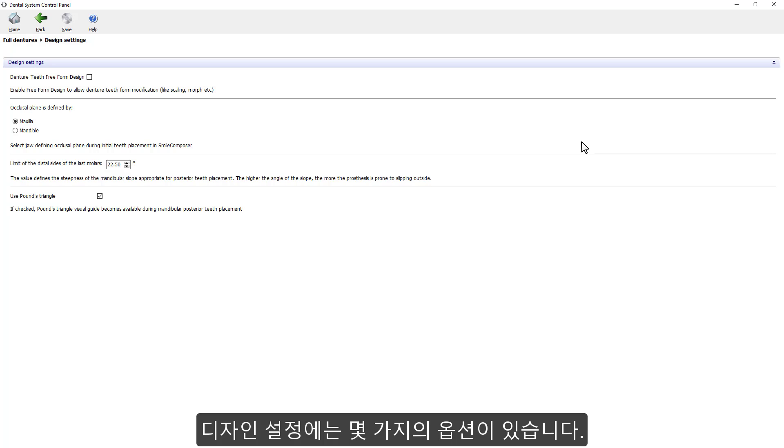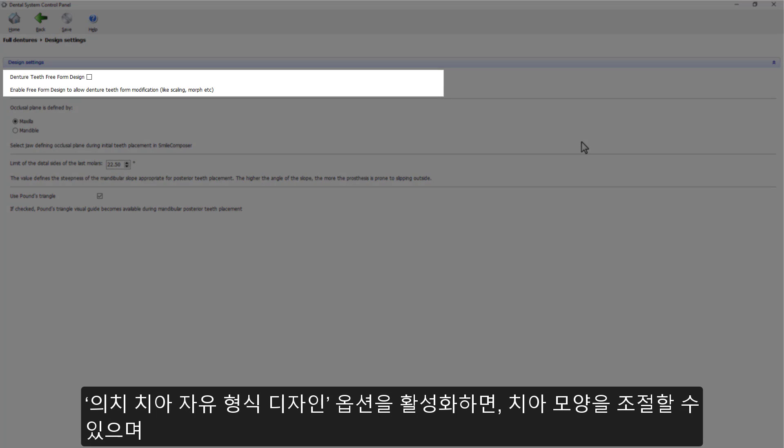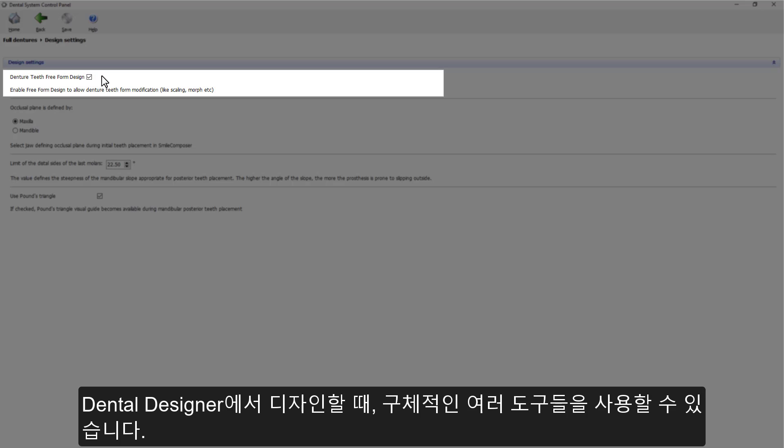You can see that there are a few options here. Firstly, you have a checkbox for denture teeth free-form design. If you are going to enable it, that means you will be able to change the teeth shape. You will be able to use more specific tools while designing in the Dental Designer.